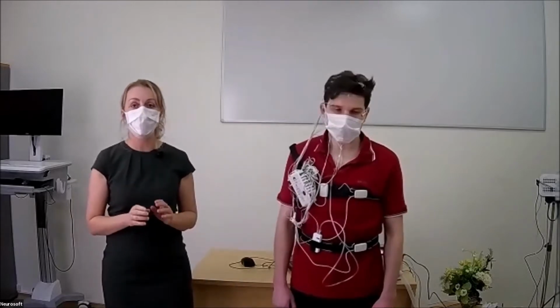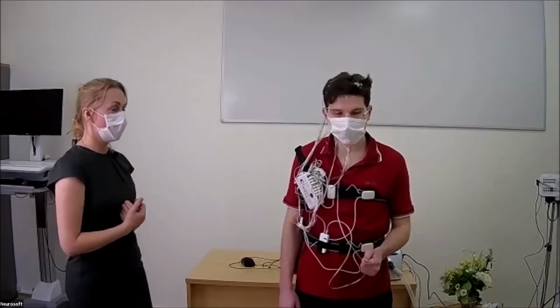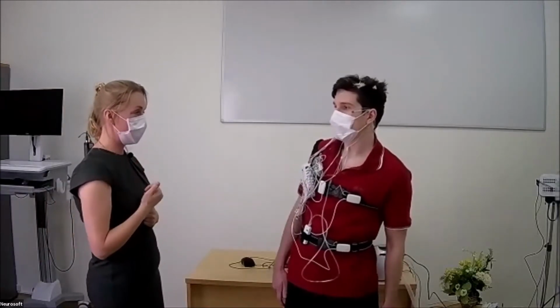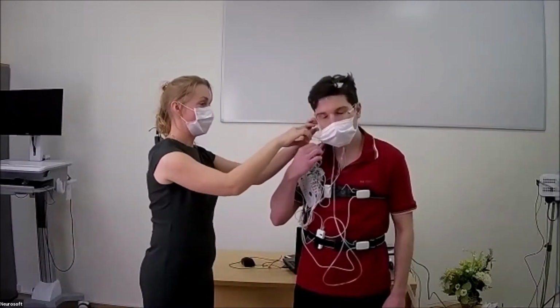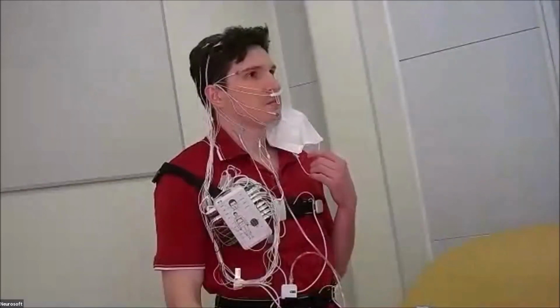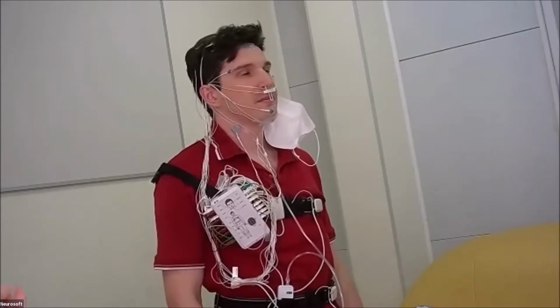So now we have 6 EEG derivations, and we put 2 EOG derivations. The last channel for sleep staging is electromyography. So we ask Anton to take off the mask. Oh, sorry, I will help you. And so we can see the electromyography electrodes which were put on the chin.